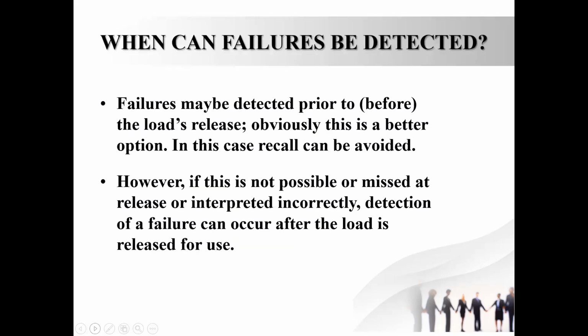When can failures be detected? They can be detected prior to, that is before, the load's release. This is a better option. You don't have to recall the items then. Sometimes they are detected after the load is released. It may be missed at release or not interpreted properly, or detected after the load has gone to the user department. So this is failure after release.